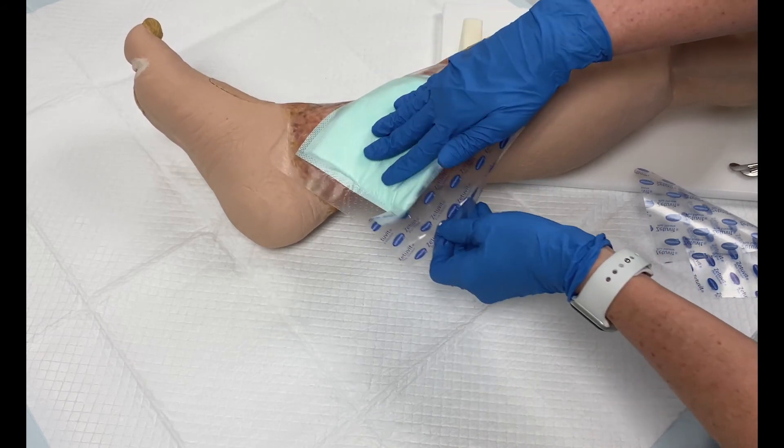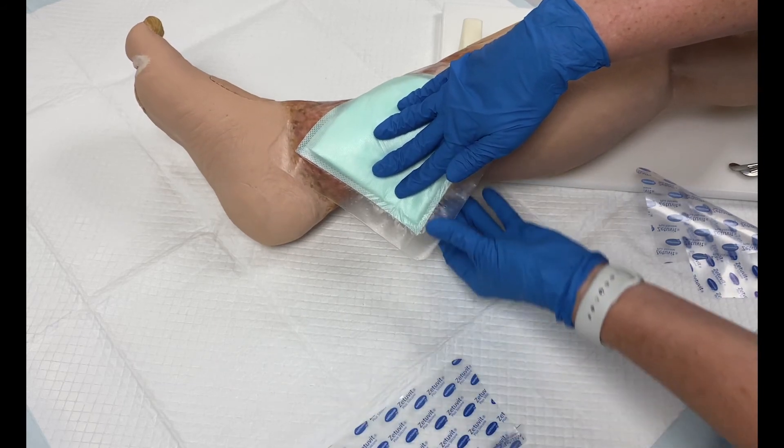Remove the second release film. Without stretching the dressing, secure the border to minimize wrinkles.